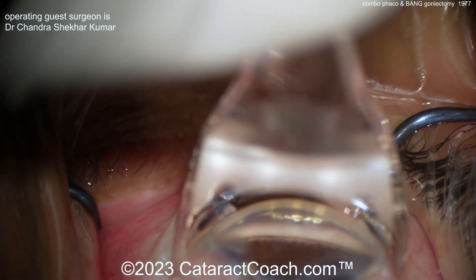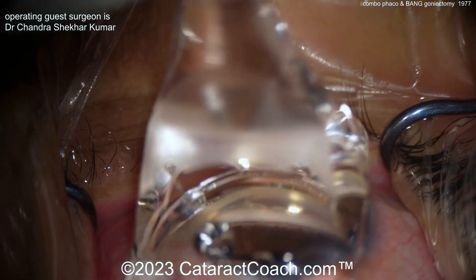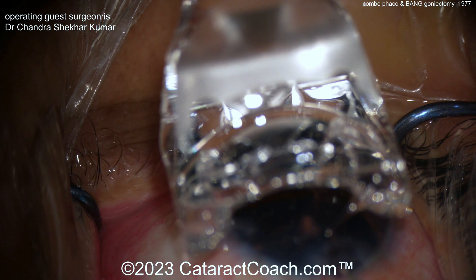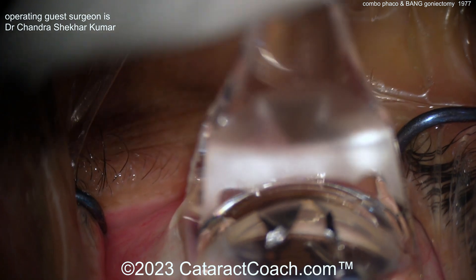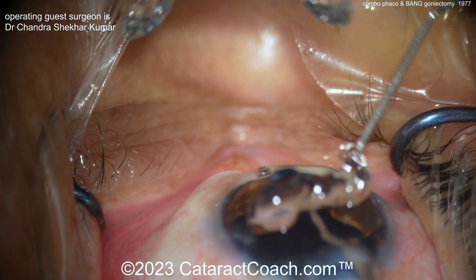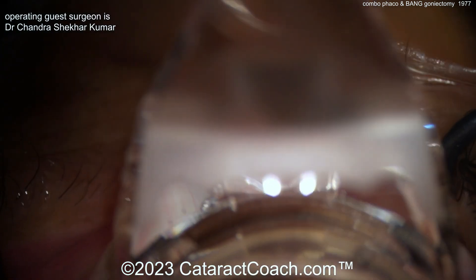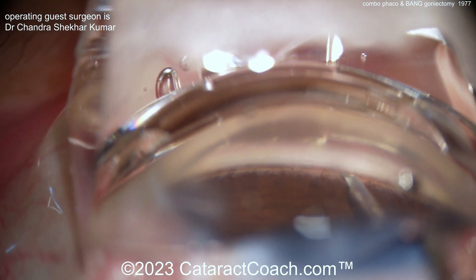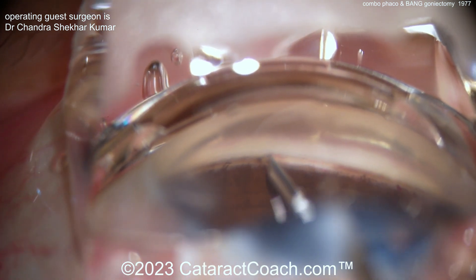Wow, that's a really nice view. Now you can zoom in, get that centered up. All you do is basically pass this needle along the trabecular meshwork to open it up. The surgeon is going to put the needle through the main incision — you could also go through paracentesis if you wanted. Once you get centered, get the bubbles out; you may need a little more viscoelastic. More viscoelastic is always easier. That's a much better view — zoom in, get it focused just right.